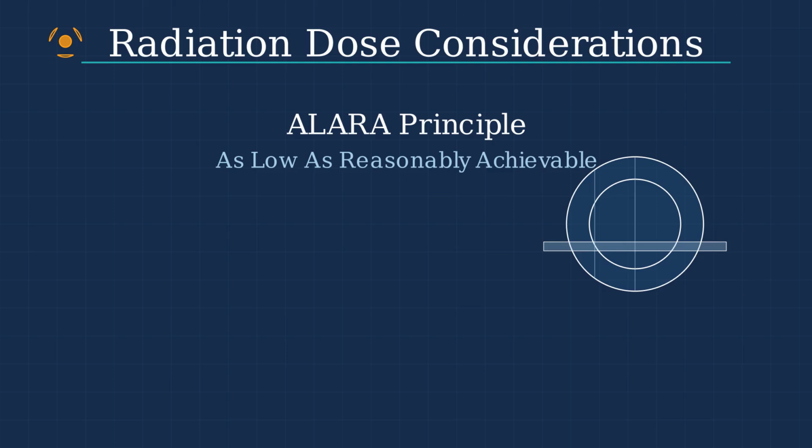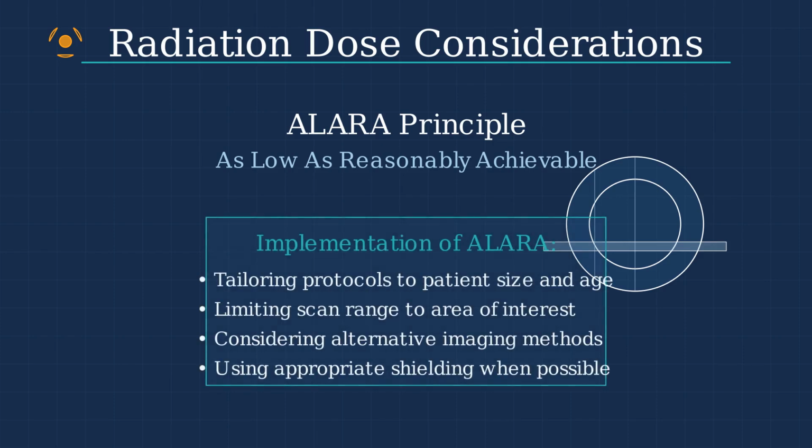as low as reasonably achievable. This guides all decisions about radiation exposure in medical imaging. The ALARA principle is implemented through multiple strategies. These include tailoring protocols to individual patients, limiting scan range to only the area of interest, considering alternative imaging methods, and using appropriate shielding when possible.